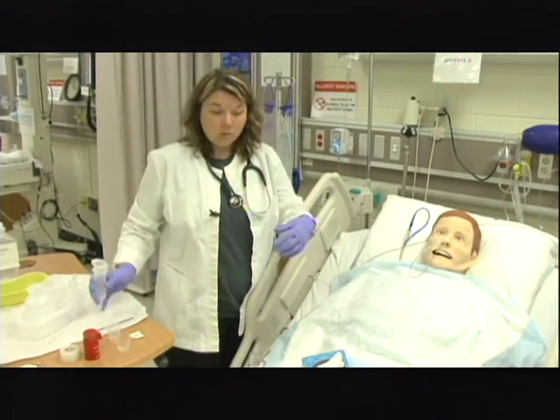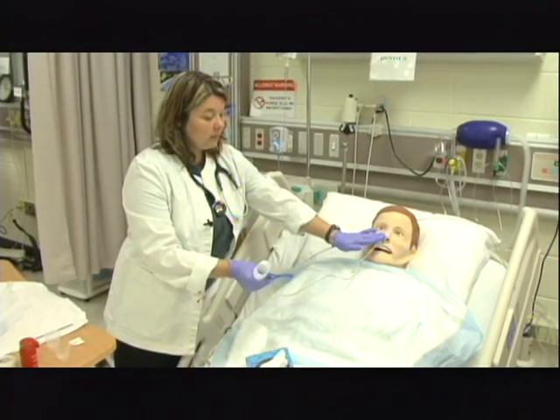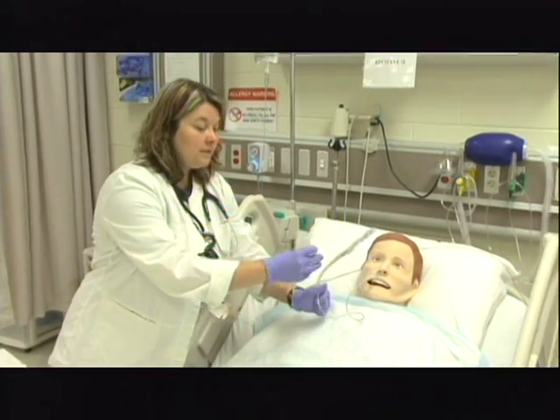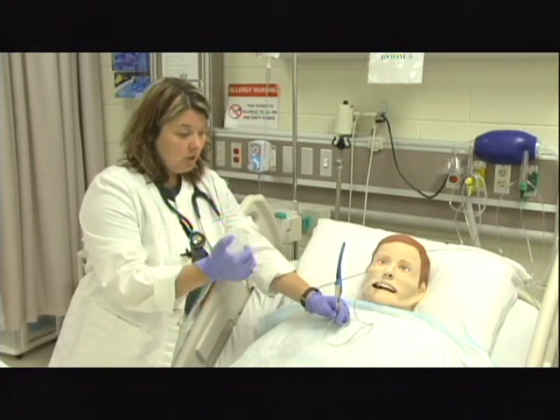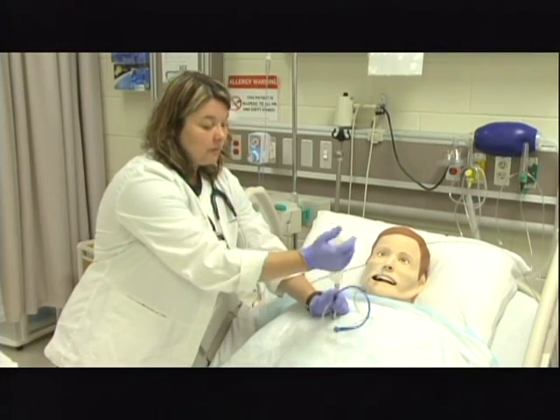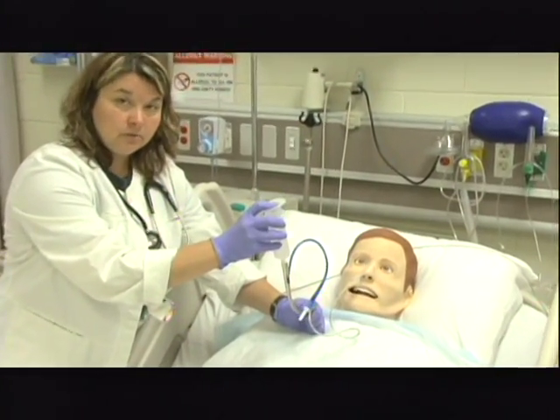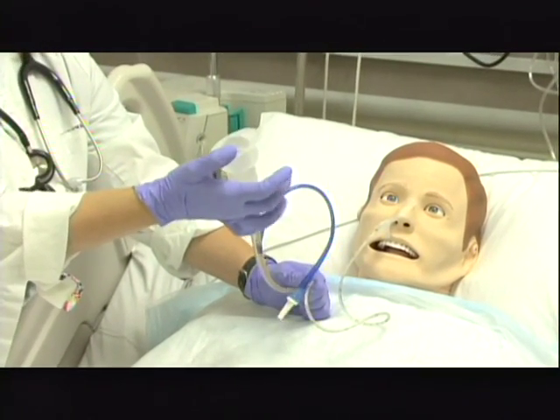The next thing I'm going to do is come over and grab the tube without pulling on the patient's nose. Again, I've already confirmed placement. I must come down here and clamp the tube. Now, one difference you'll note here is that I do not have the plunger in the syringe. Therefore, when I take the anti-reflux valve out and put the syringe in, I must continue clamping with my hand, because if I do not, I'm allowing air to enter the patient or secretions to potentially back out of the patient since the plunger is no longer in here.